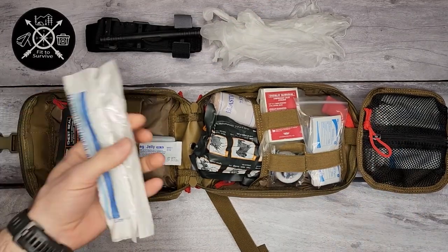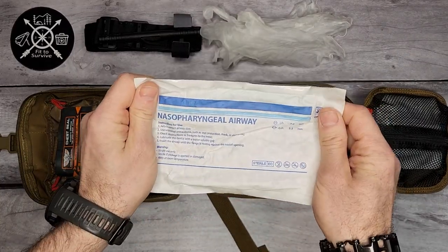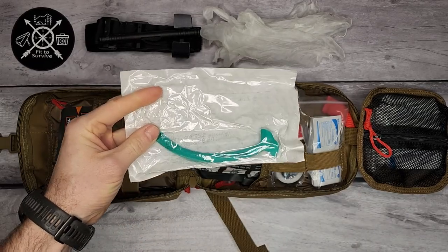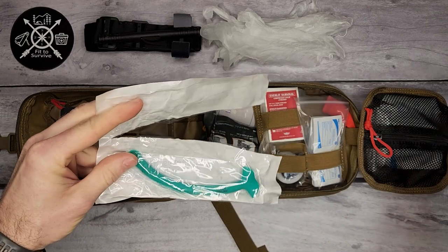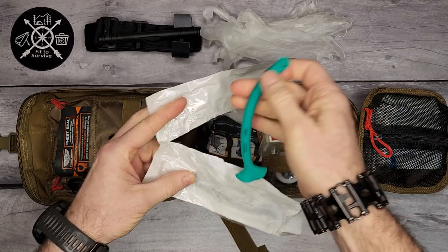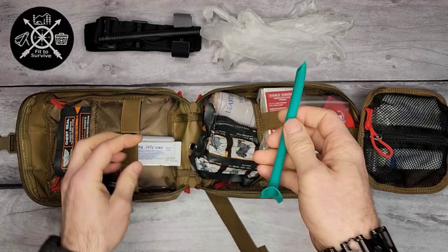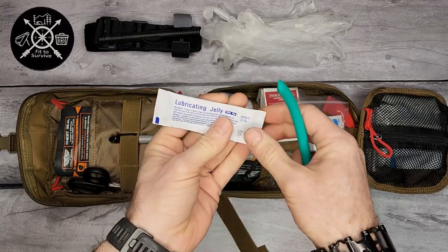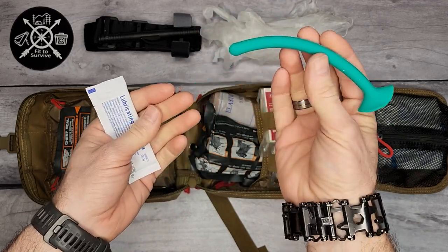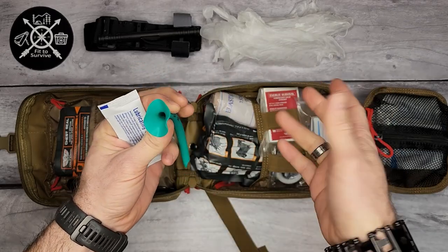An interesting piece of equipment here is the nasopharyngeal airway. This tube is basically meant to open up the airway, but instead of going through the mouth, you go in through the nostril. It's a really soft rubber piece, and right next to it you have a lubricating jelly. You dip this into the jelly, insert it through the nostril, and that provides the airway needed.